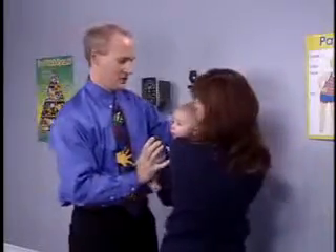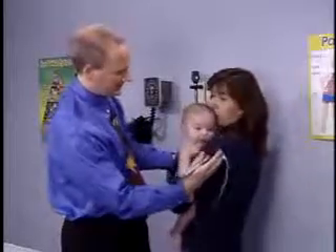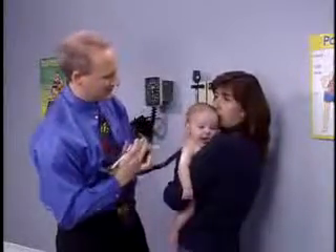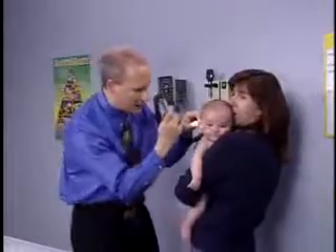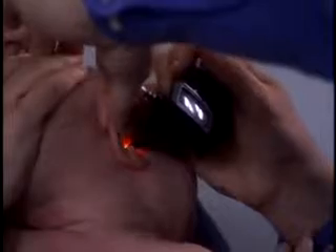Apply gentle traction on the pinna toward the back of the head. Hold the otoscope with the handle up between your thumb and first two fingers, resting the pinky and palm against the head. If the baby resists and turns his head toward you, the otoscope will be pushed away rather than inserted too far into the canal.